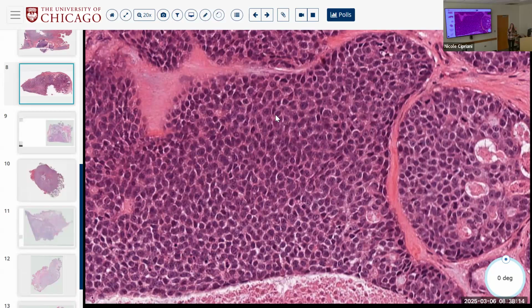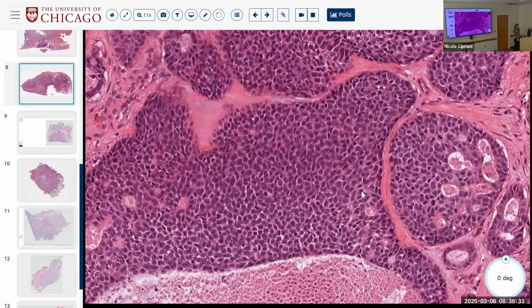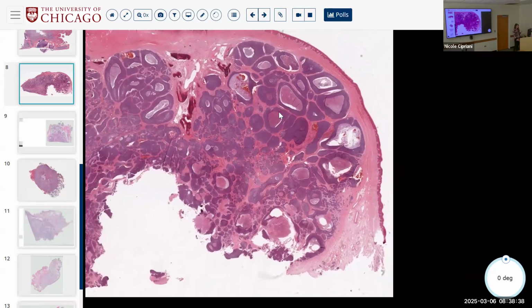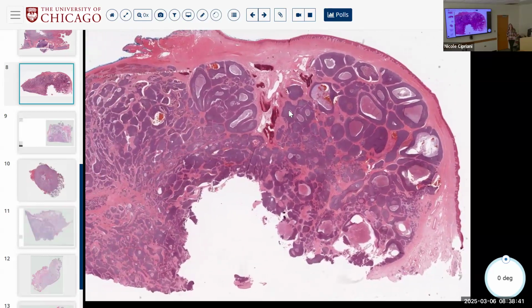But your trigger is this is a high-grade salivary type carcinoma, in which if you needed to, you could prove adenoid cystic by genetics, but you've given the clinical team their treatment protocol, which is this is high grade. Okay, so this is a high grade adenoid cystic. But I thought it was a nice example of what happens when salivary carcinomas turn high grade. They often lose a lot of their underlying hints as to what they are. So you have to look carefully and or use genetics.